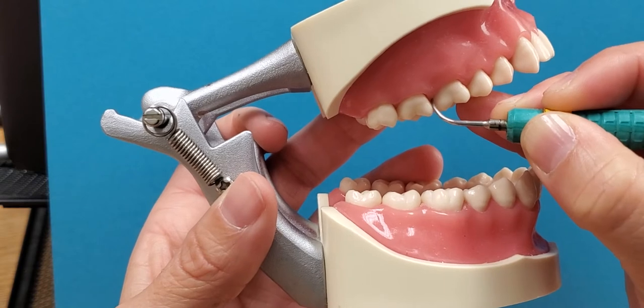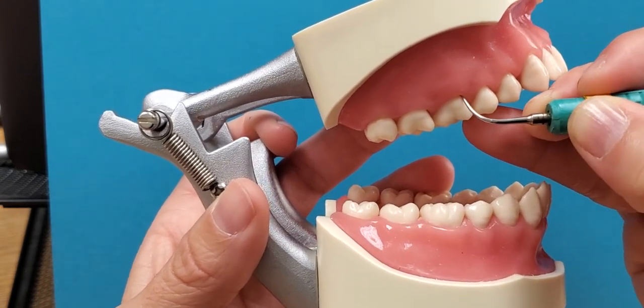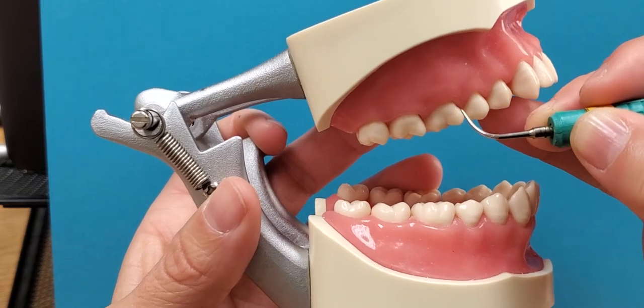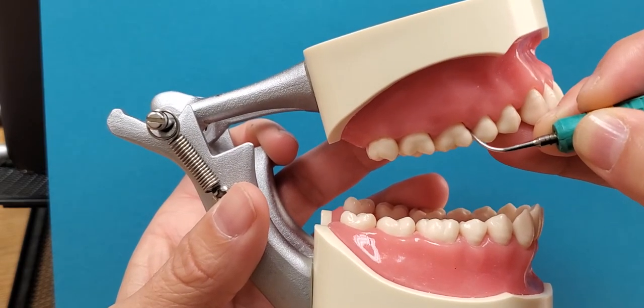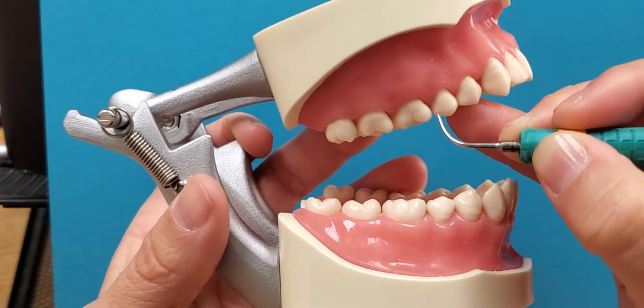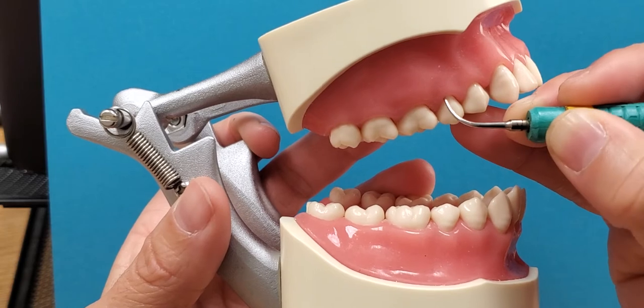Reposition for the distal contact, tap there, sweeping motion across the straight, and then tapping again, mesial contact. Probe style ultrasonic instrumentation.